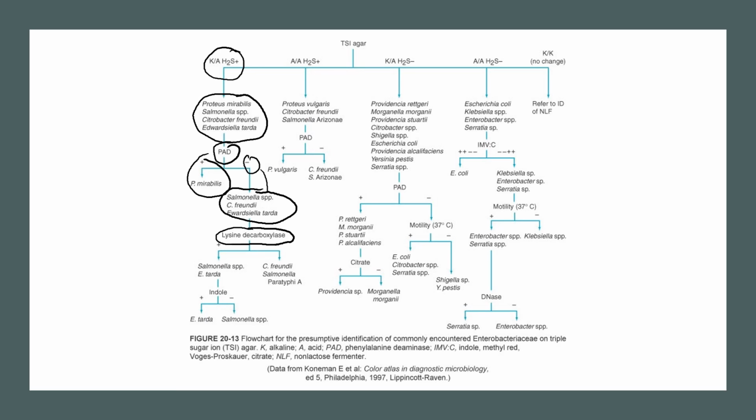So here with the lysine decarboxylase test, a positive decarboxylase will differentiate your Salmonella from the Citrobacter. And then you can differentiate Salmonella from Edwardsiella with the indole test.